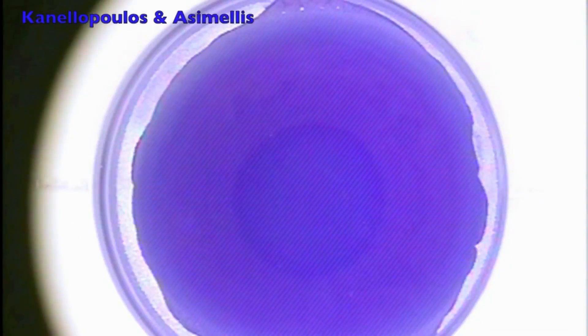The only difference here is this is a darker iris. And please note that at the bottom of your image, this is the surgeon's view, the much wider channel, which is the venting channel for lamellar cut completion of the flap. I'll let George narrate the next eye of that same patient. Now we see the white flap. It starts creating less than six seconds. Absolutely no OBL in this one.